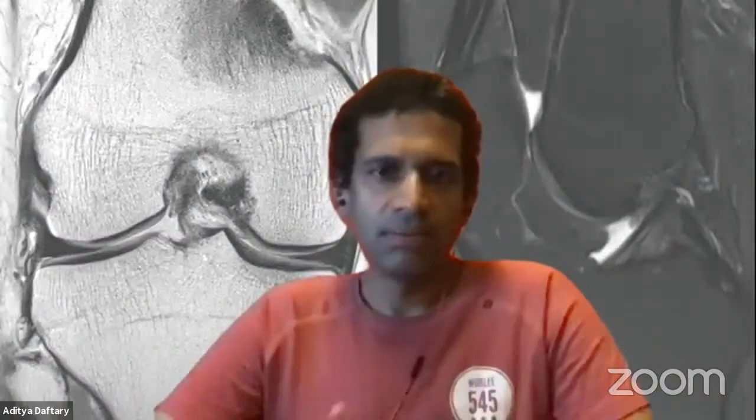That is one scenario. The second scenario: what is the use of hemarthrosis in relation to imaging? Because as an orthopedic surgeon, I always thought it would act like contrast. There is already some fluid inside, so with small meniscal tears the fluid will seep in and we will see it better. So is it good practice to evacuate it and then send the patient to you for MRI, or hold the hemarthrosis and send it, because smaller lesions, as the fluid can seep into smaller tears, you can find them better?